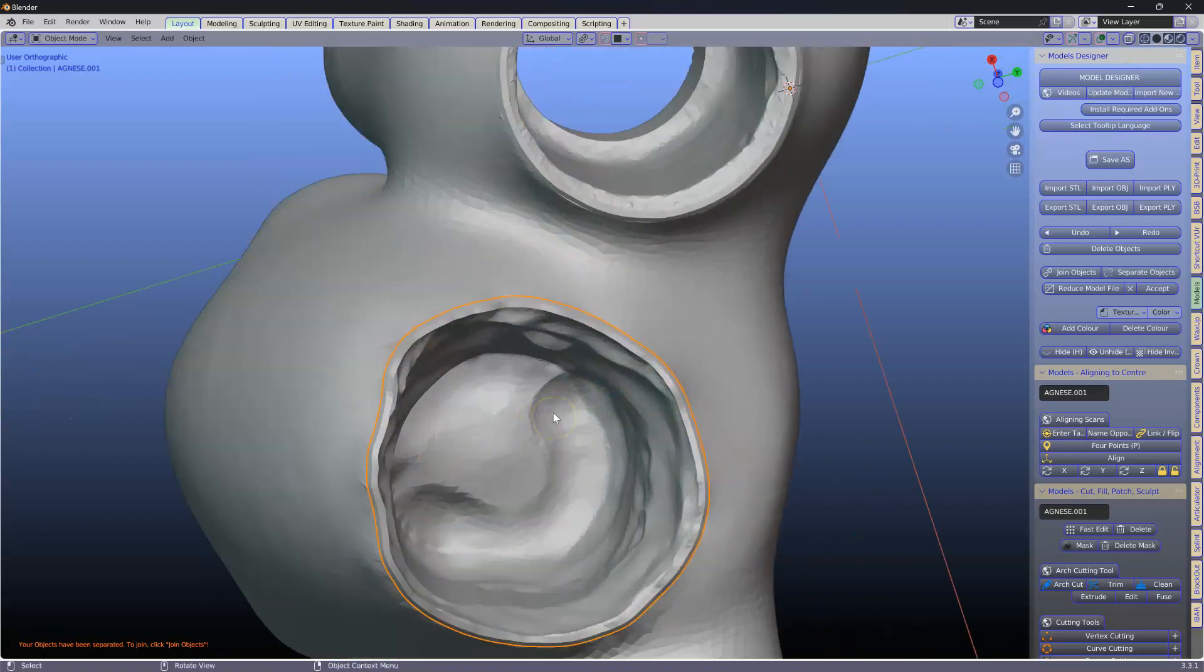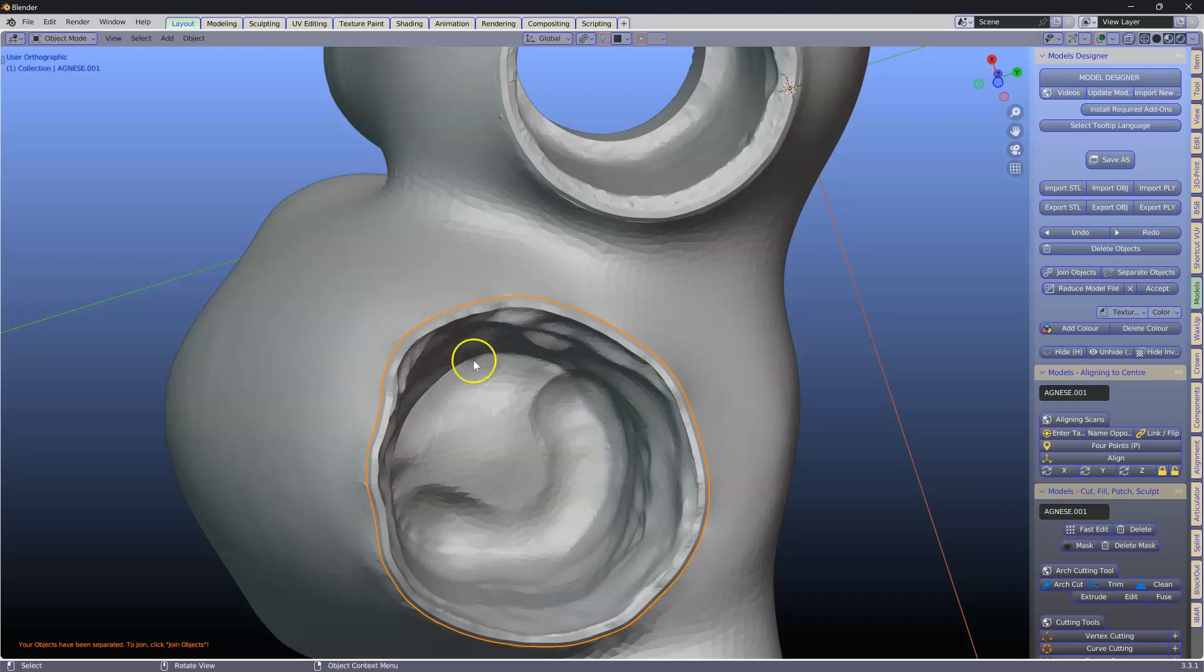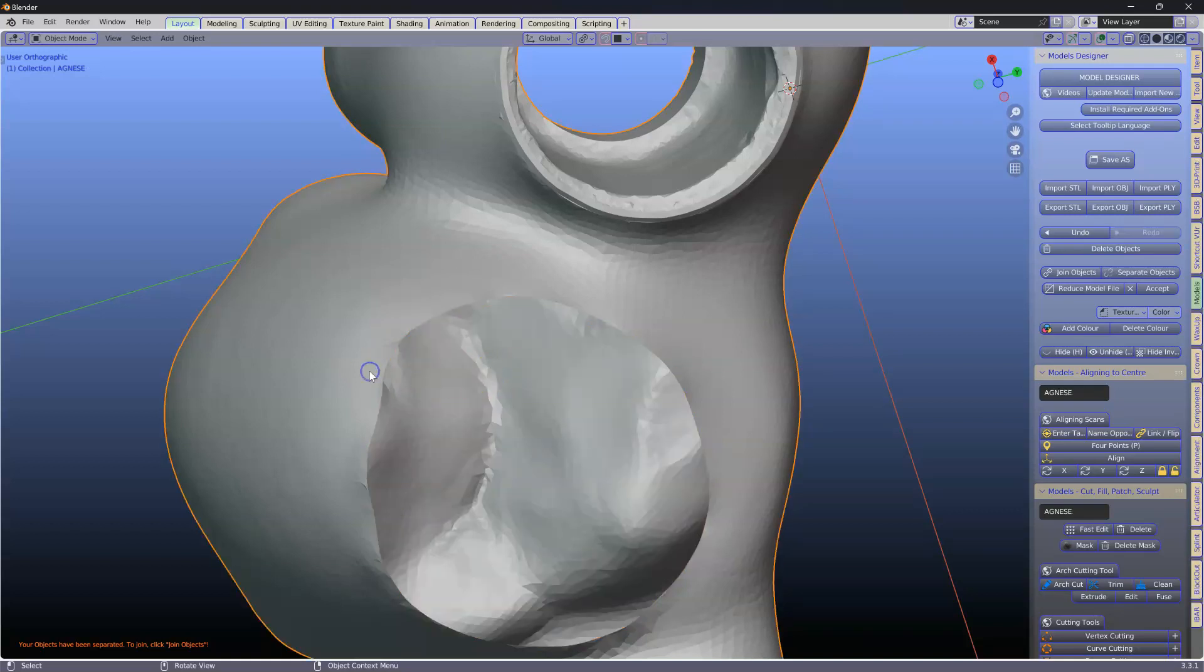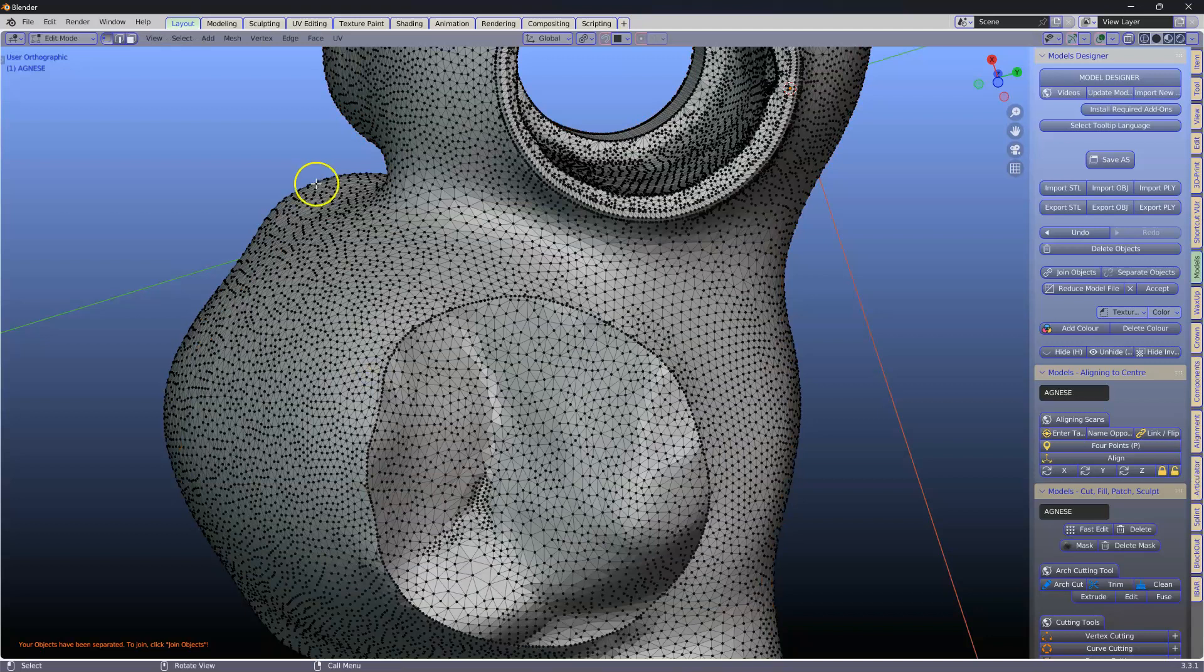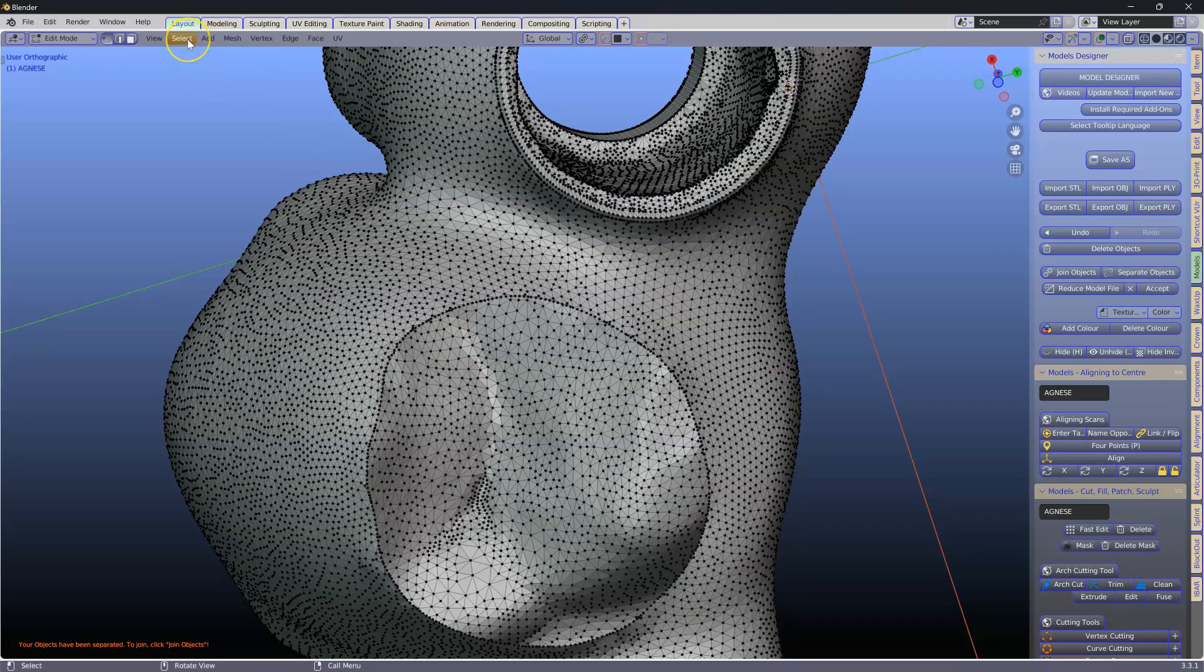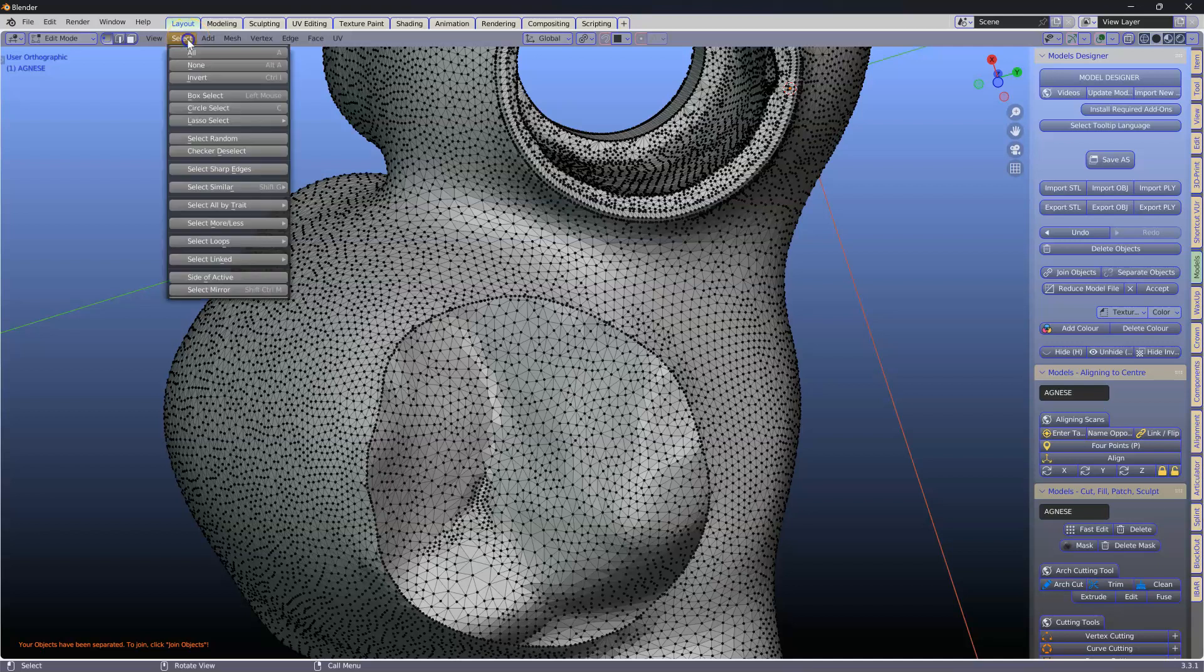So what we want to do is merge it. I'm going to use the H key to hide it. Tab. Nothing is selected. Alt A to deselect everything if there is something selected.